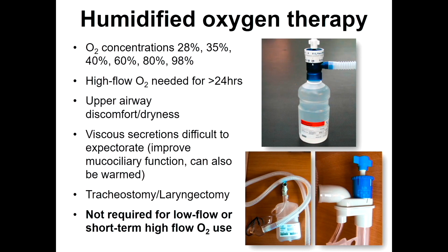We do use humidified oxygen for individuals who have an altered airway, such as people with tracheostomy and laryngectomy. We don't recommend it, and when I say that, we take that from national guidelines, that there's not a lot of evidence to support the use of humidified oxygen in low flow oxygen therapy, or oxygen therapy that's required for less than 24 hours.